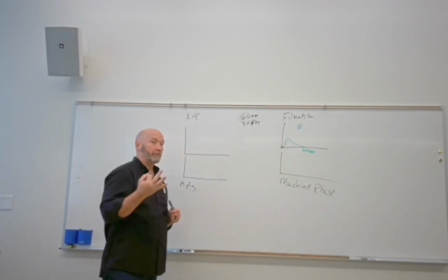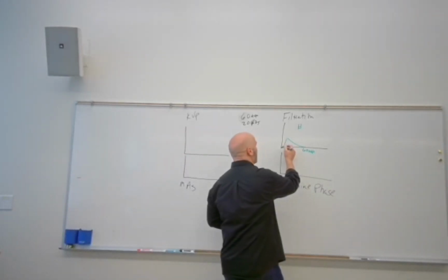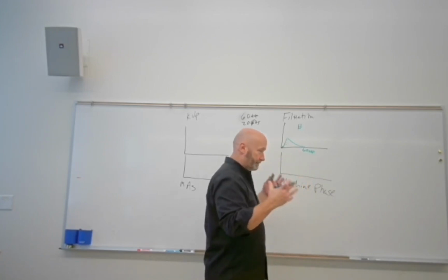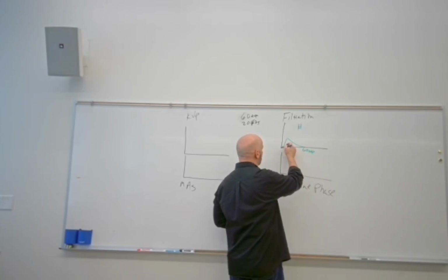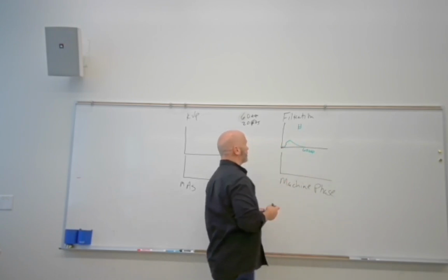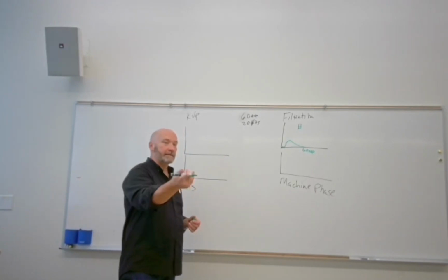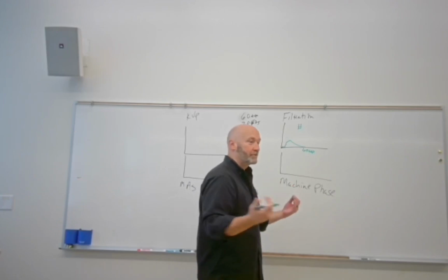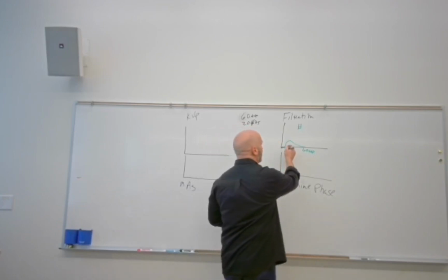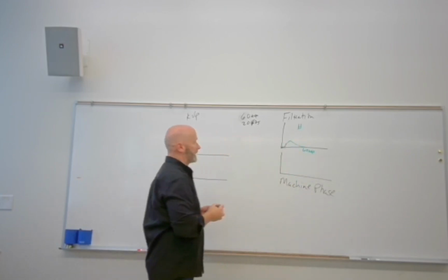And so the third thing was, who said it? Window, bingo. The window, so it's got to get out of the housing, right? And that's out of the protective housing, which we learned earlier this semester does not protect us from as much as what I thought it did. So it goes to the housing, the port, and it looks like that. And the next thing is, I think you said it, your shutters? Mirrors. The shutters don't do anything for filtration. The mirror then absorbs a little bit too. So now our Brems spectrum looks kind of like that.